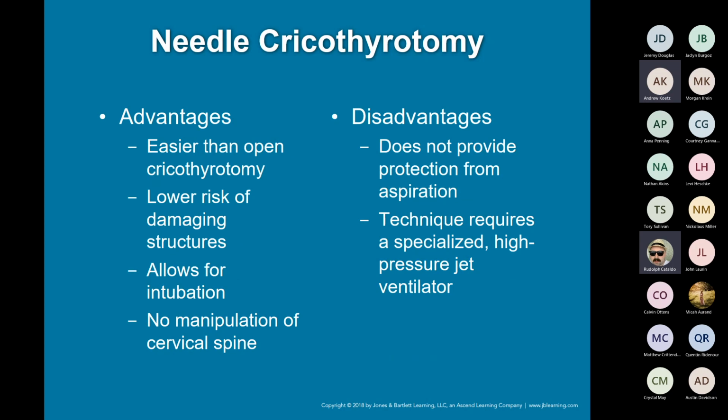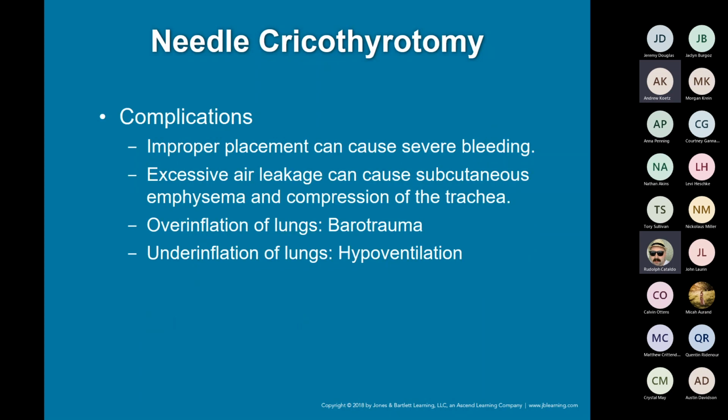Now, that transjet ventilator device can be kind of harmful in patients, especially if this is a trauma and the patient has a potential for having a pneumothorax. I'm a little more concerned at that point with doing this because I'm introducing a huge amount of pressure in the chest. And remember, the more pressure I introduce into the chest, the more the blood pressure can drop. So especially with patients that are borderline hypotensive, I have to be really careful how much air I'm introducing to their chest, because that's pushing on their blood vessels and not allowing blood to return back into their heart.